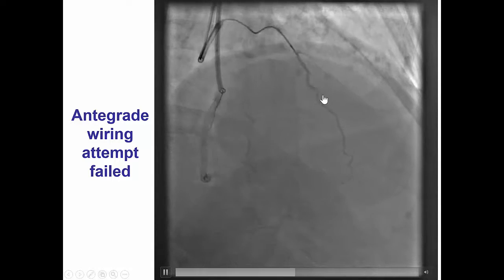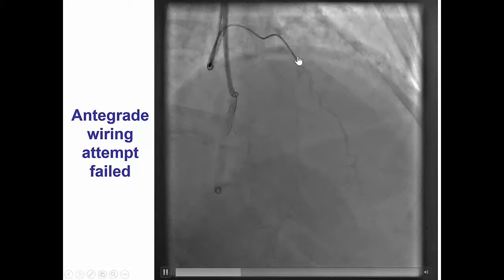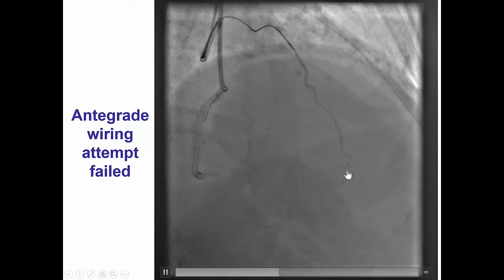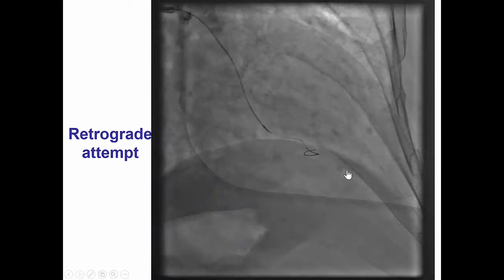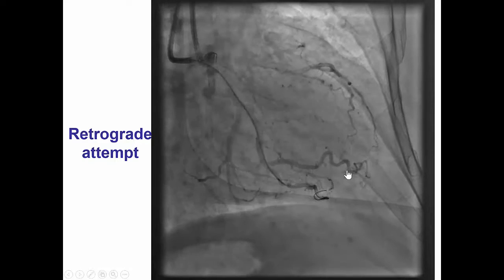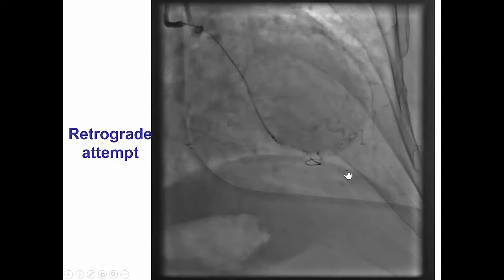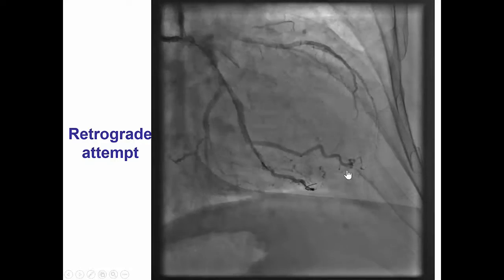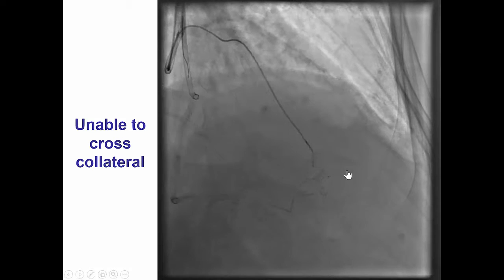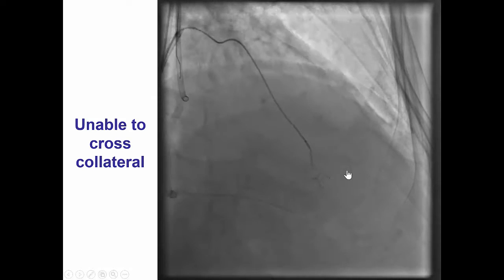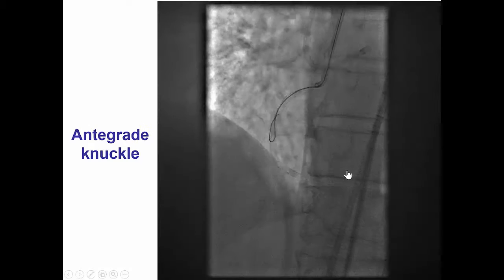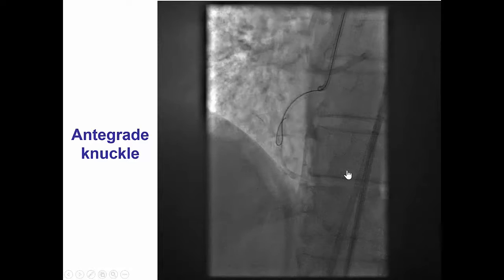We performed some retrograde crossing attempts. This is a selective injection of the epicardial collateral going to the PDA. However, despite several attempts, there was marked tortuosity in the vessel and we were unable to cross that epicardial collateral from the circumflex into the posterior descending artery.